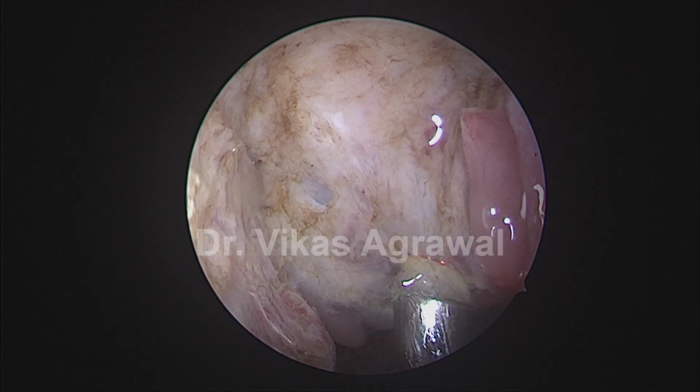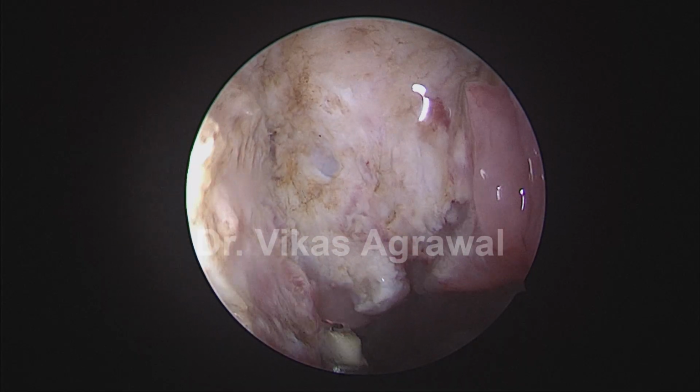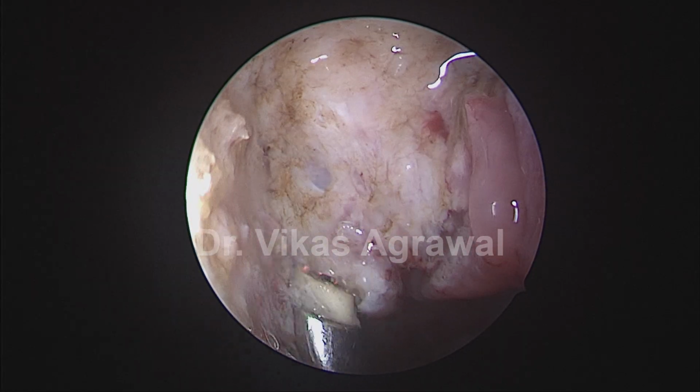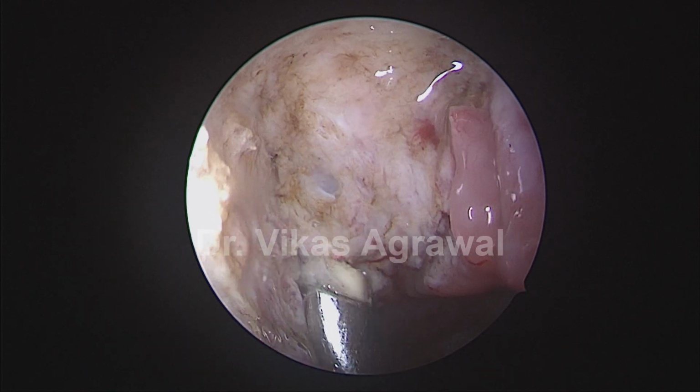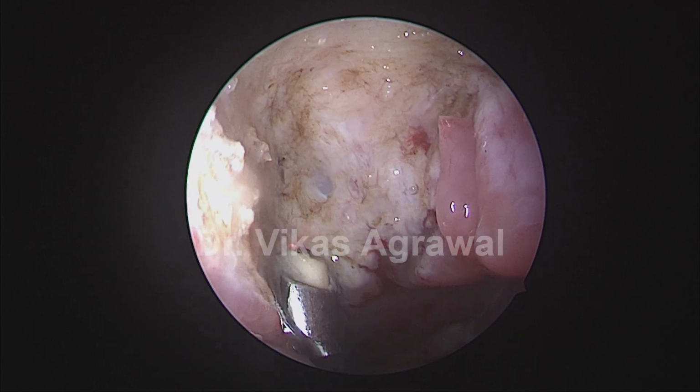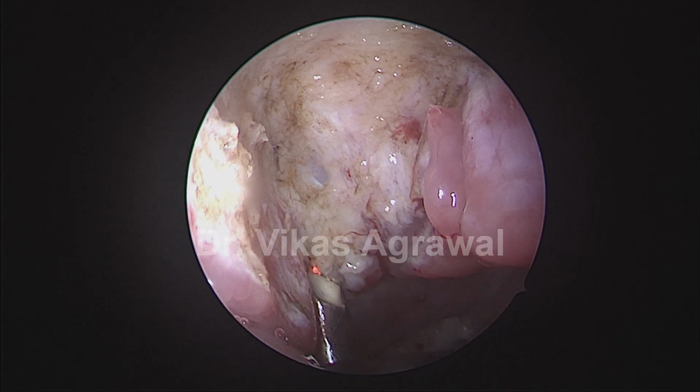And then I will come to the inferior boundary, which is the Passavant's ridge. You can see the adenoids are ending over here. That is the inferior boundary. And that's the Passavant's ridge. You'll see the horizontal contraction in a moment.